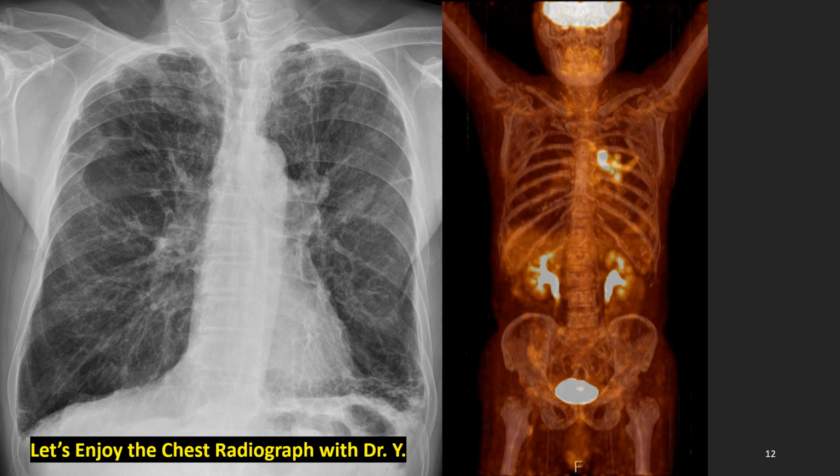From the beginning of this session, I have told you that manifestation as a nodule of small cell lung cancer is not common. It's rare. Yes, this image is a PET CT, MIP image. MIP is maximum intensity projection.